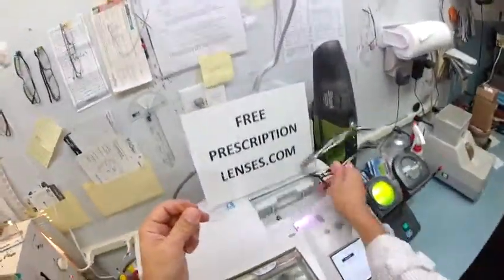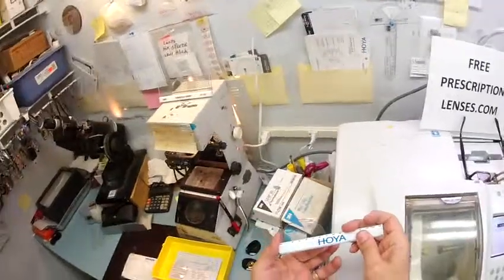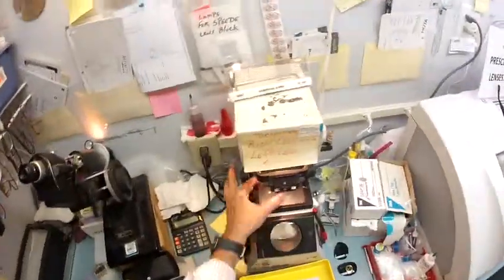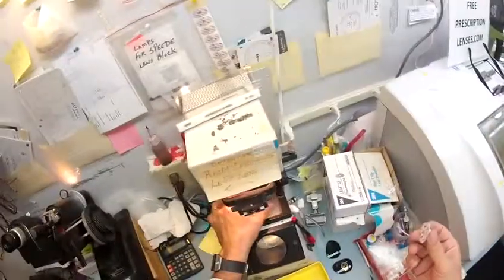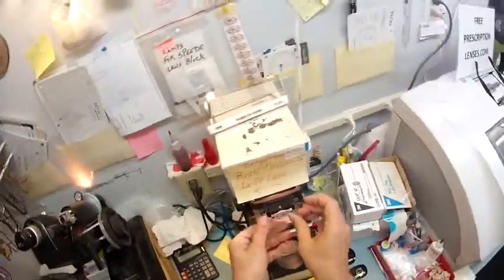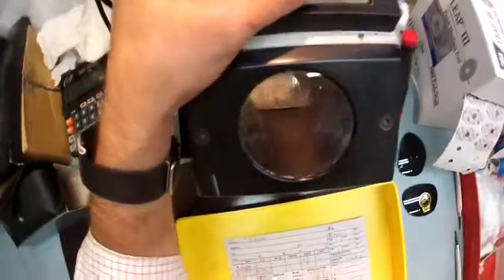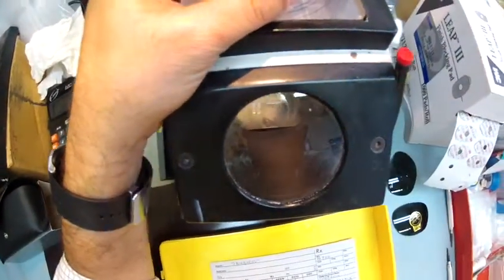Here are your lenses. This is what they look like before I cut them. I've just got to get them down to this shape. So what I'm going to do is I need to put this block on here. This is what's going to hold it in place while it is cutting. So I'm going to put this block on, pull the little sticker off, and believe it or not, it's a little 3M pad. The same people who make the Post-it notes make the little sticky pads that go on our blocks. So I've got this lined up, and what I'm doing is just getting everything lined up.